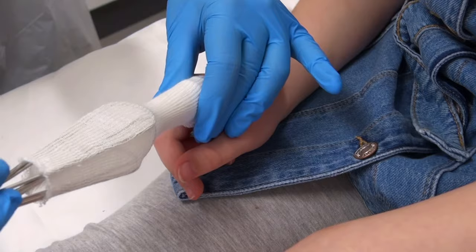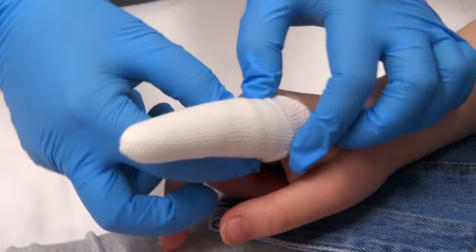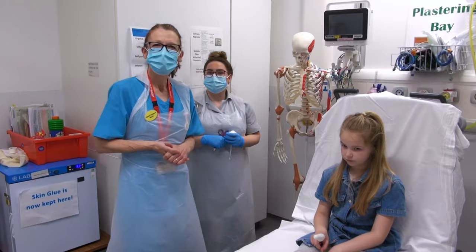Feed it through as you're going down. And then twizzle it. And then feed it through. To secure the bottom ends you'll just need this elastoplast tape. And that's how we put on a finger dressing.